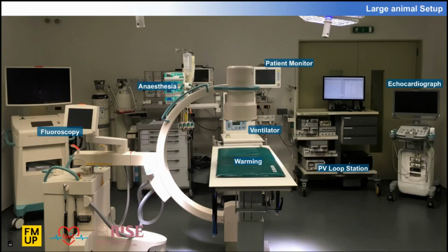So in this photo, you can see our large animal lab where we perform all of our procedures. It is a hybrid operating room, as it allows for both cardiac surgery and fluoroscopy-guided procedures to be performed. So we have our radio-transparent surgical table with a warming pad on top of it, our ventilator and patient monitor, our syringe pumps for anesthetic delivery, the fluoroscopy system to guide the procedures, an ultrasound system for transthoracic echocardiography and to perform ultrasound-guided vascular accesses, and finally, our PV loop station.